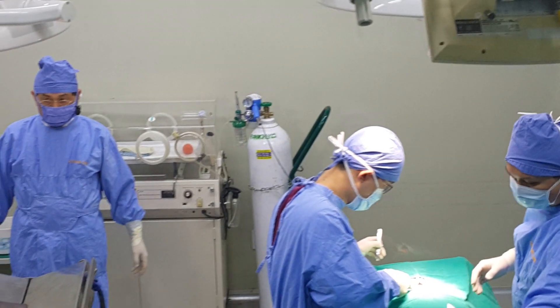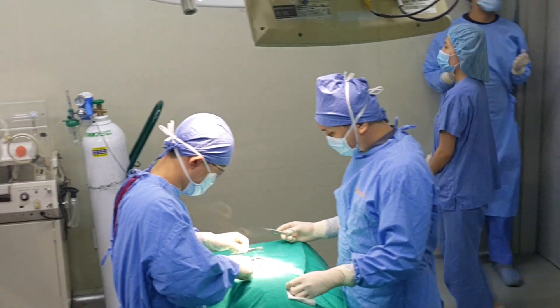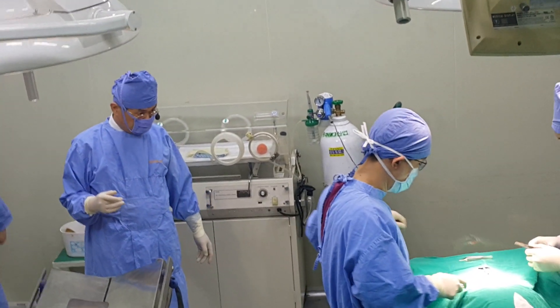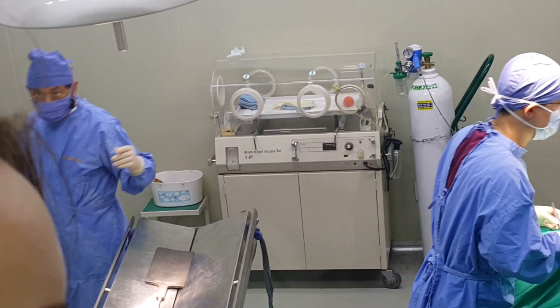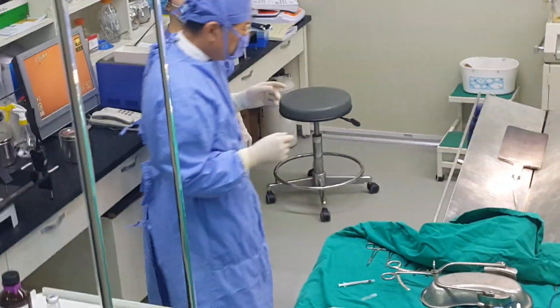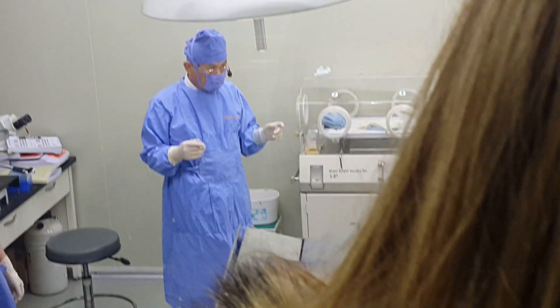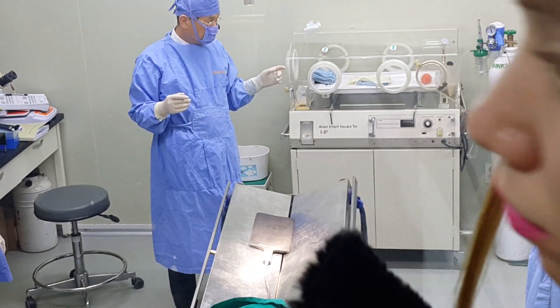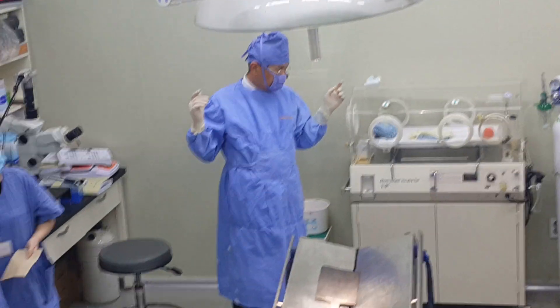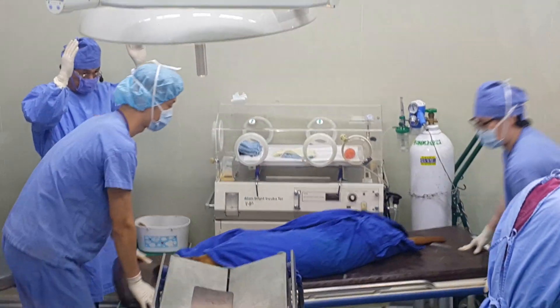The name is off the record, but the original name of the dog is Molly. It's a special case where the body had been frozen. As I mentioned, freezing damages the cell, but after considerable difficulty we have been able to salvage the cell. After the embryo transfer process, after 60 to 61 days, we'll have a healthy clone. The Russian team visitors are here just to visit our facilities, and this is just a special case.